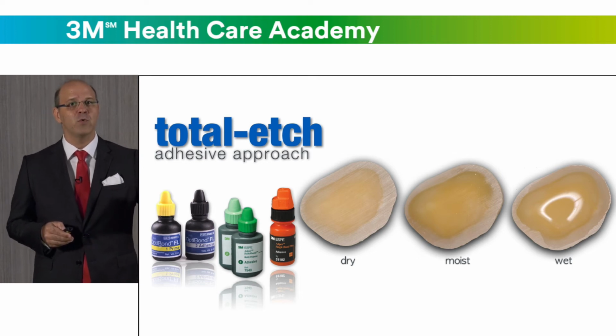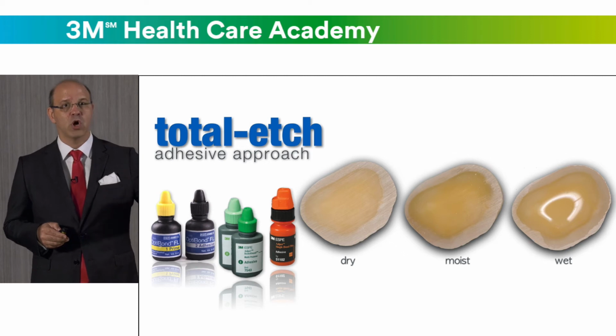For example, after you wash off your etching and dry a little bit, if you see that your dentin is too dry, you have to wet it. How to wet it? Just pick up a small cotton ball, put water on it, and pass it lightly over the dentin. That is enough for moist dentin.